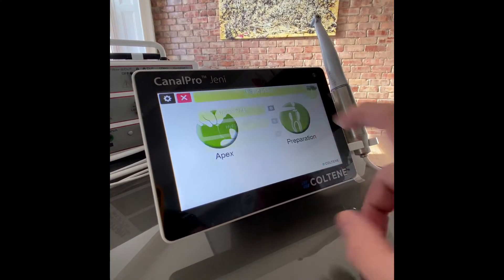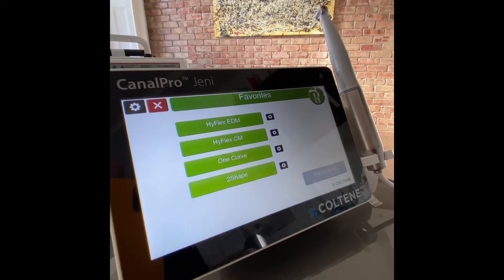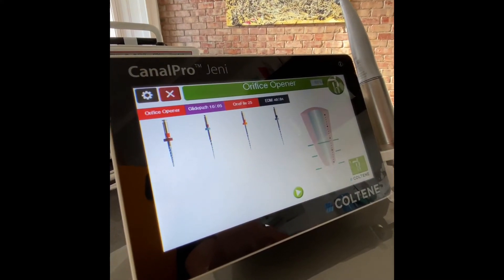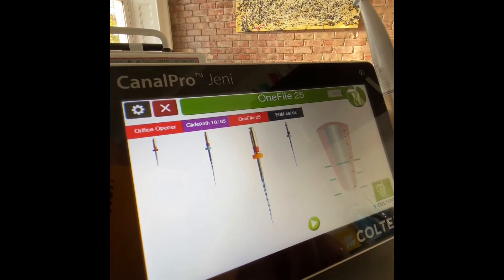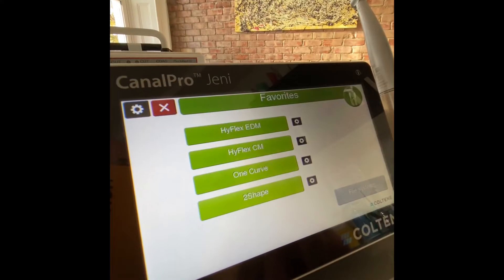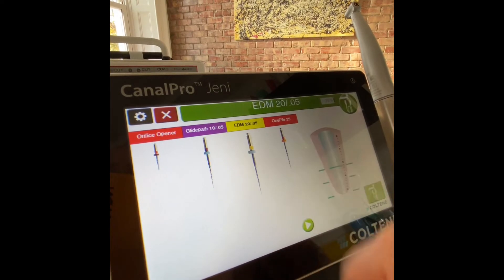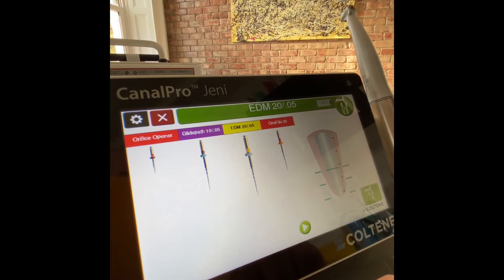You can shift between different systems. These are the four favourite rotary systems referring to Hyflex EDM, with preset settings for each file. You can choose the orifice opener, the glide path, the one file — case is complete. For set medium, for more difficult canals, you have the orifice opener, the glide path, EDM 20/05 taper, and the one file.